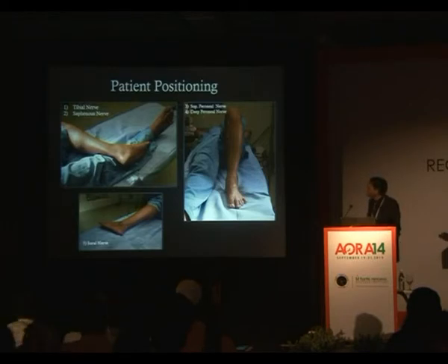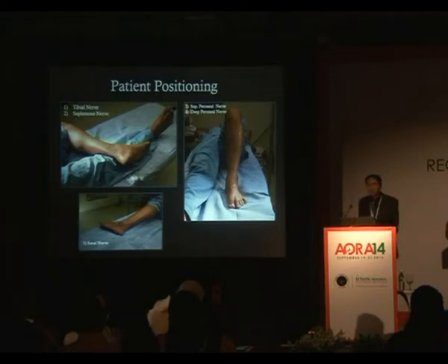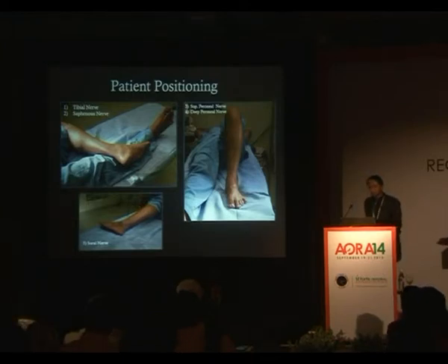With the superficial peroneal and the deep peroneal nerve, I like to place the leg this way. This gives me clear access to the front of the foot and to the lateral border of the leg, where I'd like to block the superficial peroneal. For the sural nerve, I need to turn the patient lateral and expose the part behind the lateral malleolus.